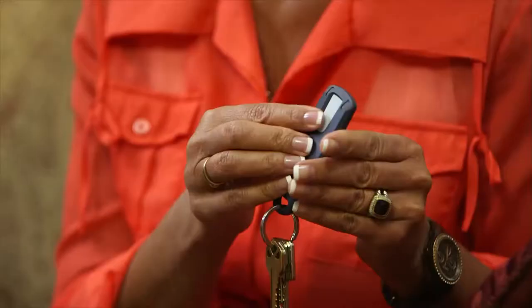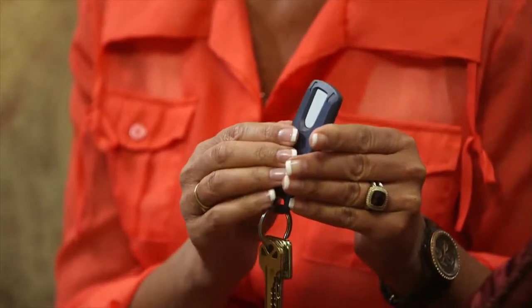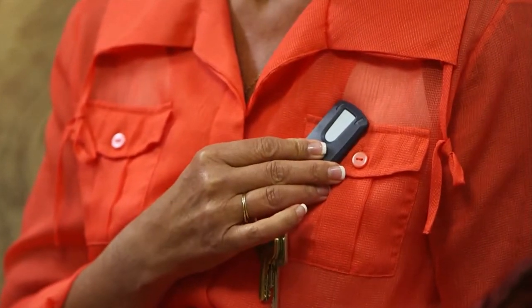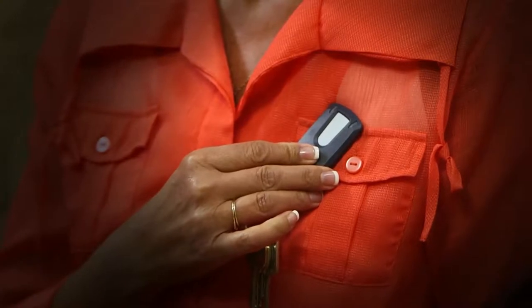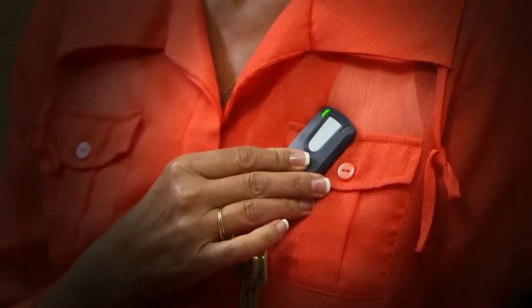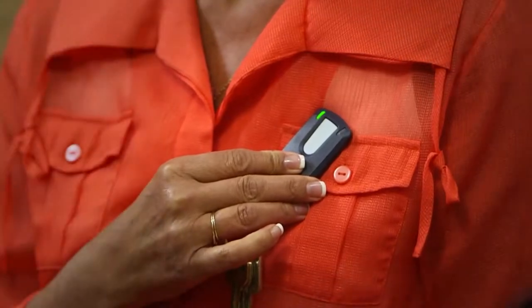Using the Patient Assistant is simple. When you experience a symptom, press and release the button — the searching light will start to flash blue. Next, hold the Patient Assistant flat against your chest, directly over your Reveal LINQ ICM. When a symptom is successfully marked, a tone will sound and the success light will illuminate green. If these signals don't occur within 15 seconds, repeat the process.